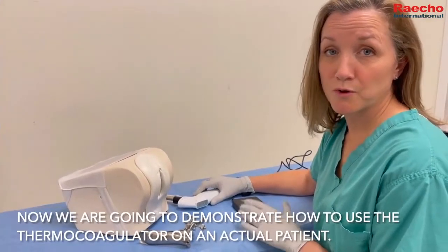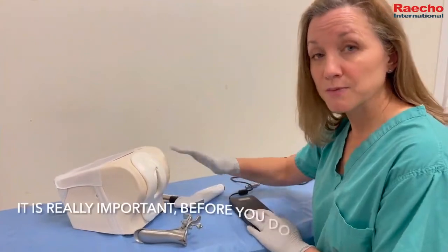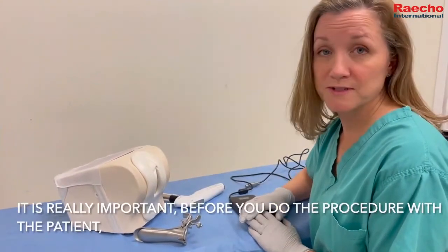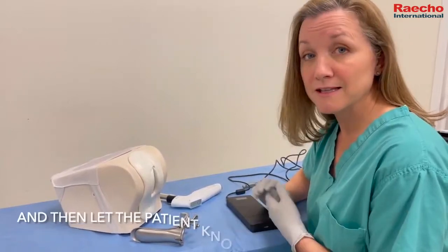Now we're going to demonstrate how to use a thermocoagulator on an actual patient — we're going to use this model. It's really important before you do the procedure with the patient that you first obtain consent from the patient.